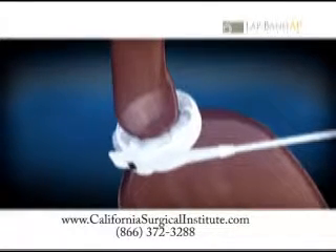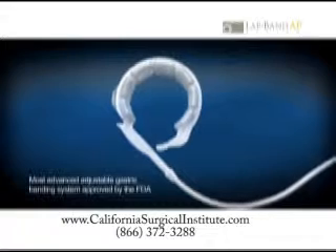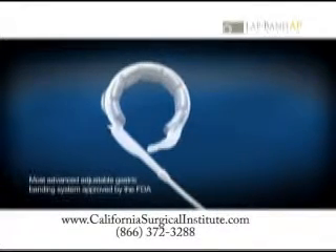The LapBand AP system is the third and latest generation LapBand system. Its design and performance are the result of seven years of U.S. experience, as well as countless collaborations with surgeons across the country.